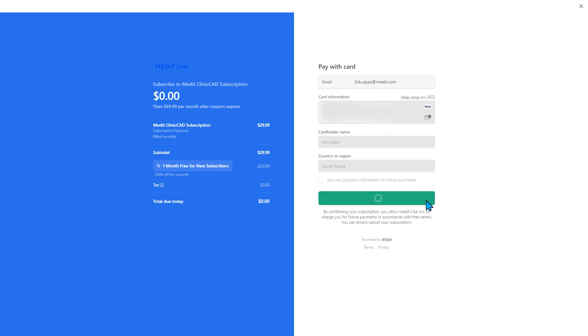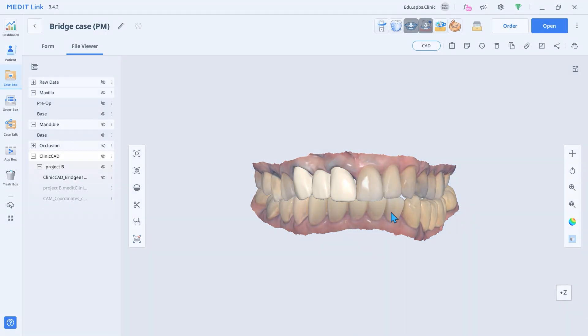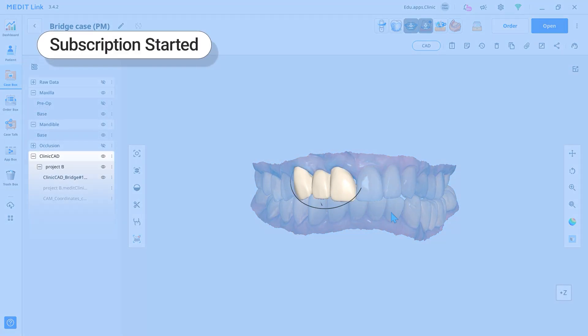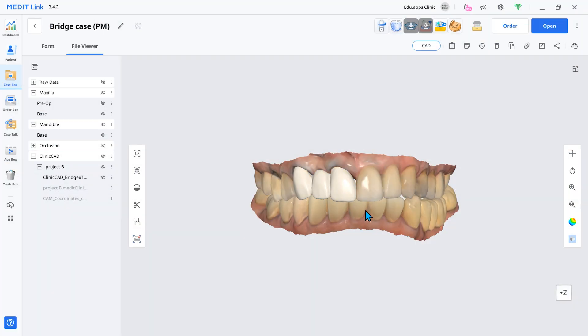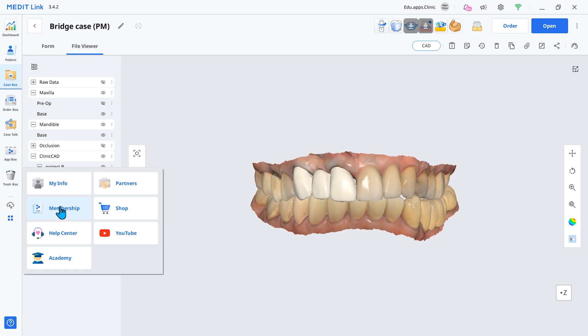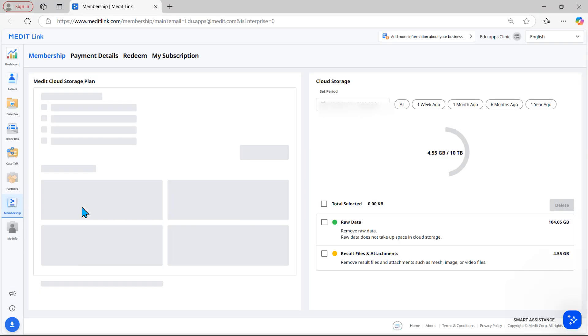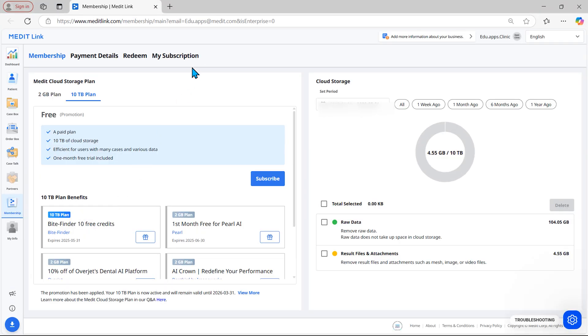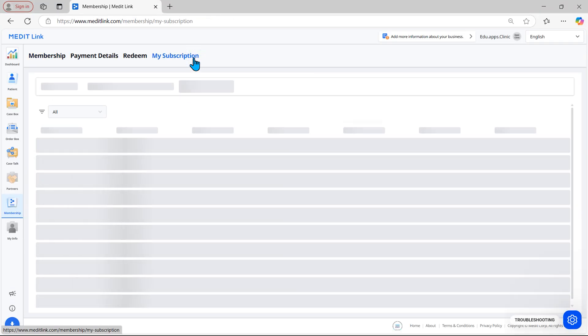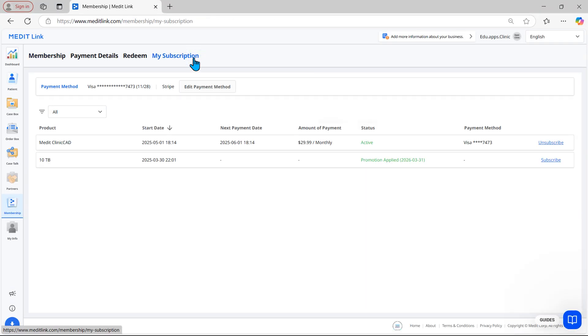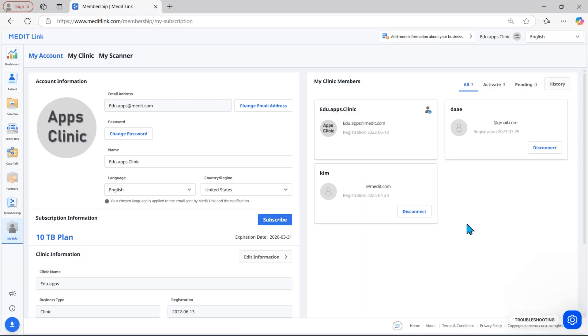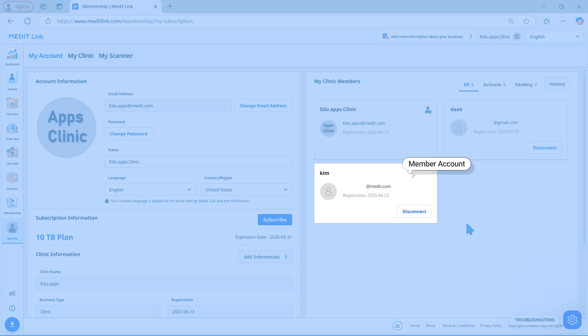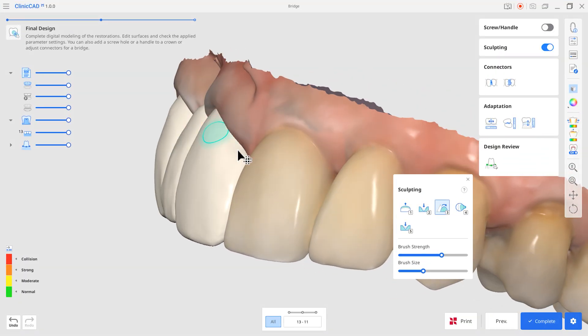After payment, the app closes and the file is extracted. With the subscription, you are free to unsubscribe at any time. Both admin and member accounts can export files once the subscription starts.